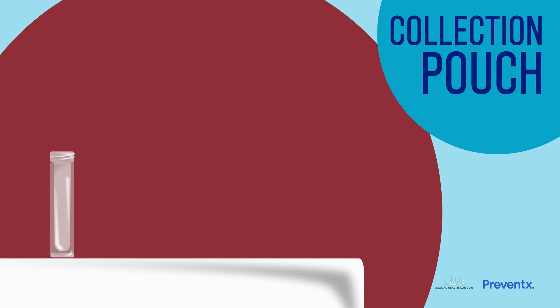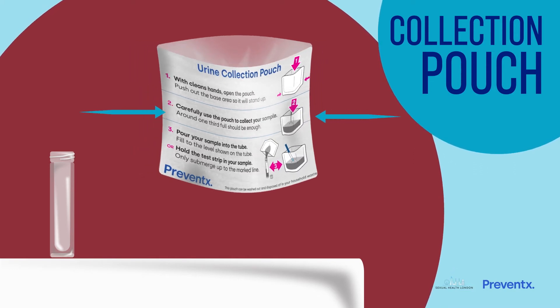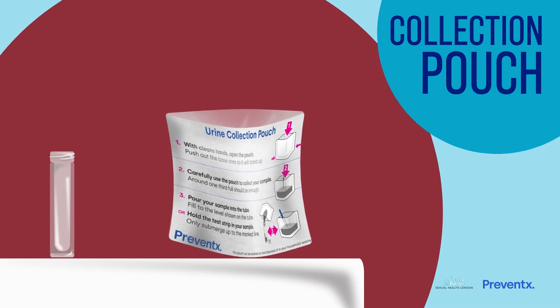The tube is quite small, so we have included a pouch to help you collect your sample and then transfer it into the tube. There are instructions on the side of the pouch and it pops open like this. Then you can stand it up if you need.